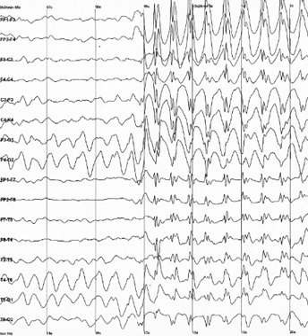There are technical difficulties associated with combining these two modalities, including the need to remove the MRI gradient artifact present during MRI acquisition and the ballistocardiographic artifact resulting from the pulsatile motion of blood and tissue from the EEG. Furthermore, currents can be induced in moving EEG electrode wires due to the magnetic field of the MRI. EEG can be used simultaneously with NIRS without major technical difficulties. There is no influence of these modalities on each other, and a combined measurement can give useful information about electrical activity as well as local hemodynamics.